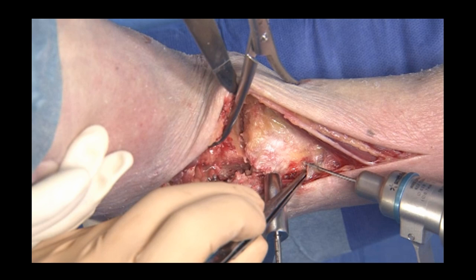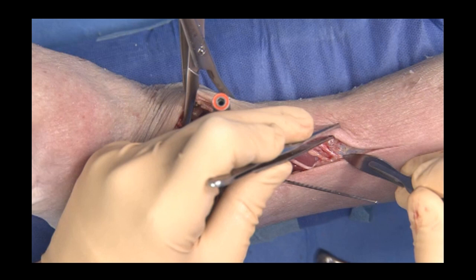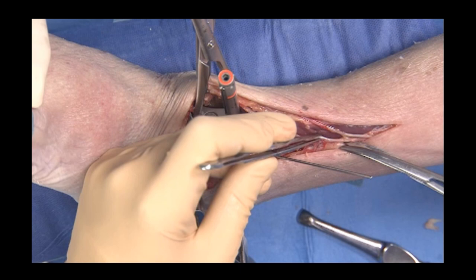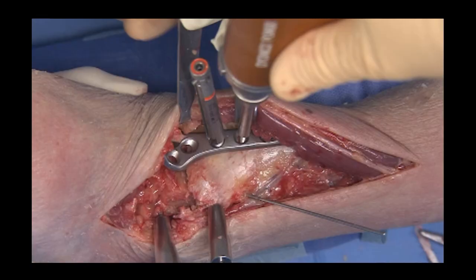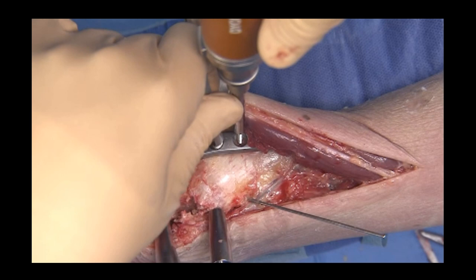The joint is stabilized with one or two 1.5 mm K-wires. The anterior Perilock plate is positioned and room is made to access the plate proximally with respect to the branches of the superficial peroneal nerve. The plate is stabilized with a provisional 2.7 mm fixation pin.